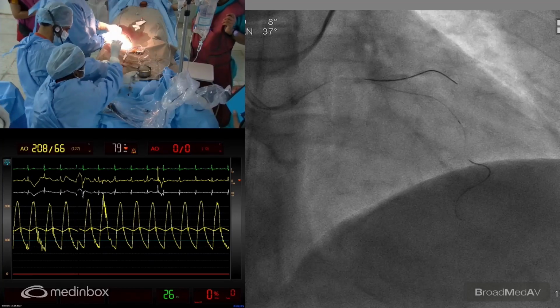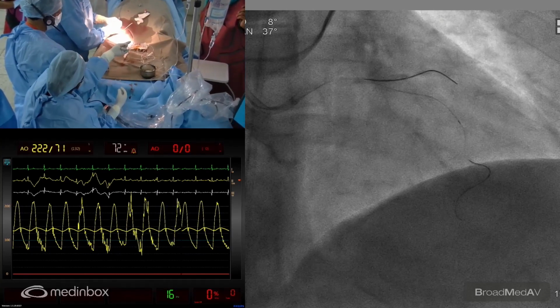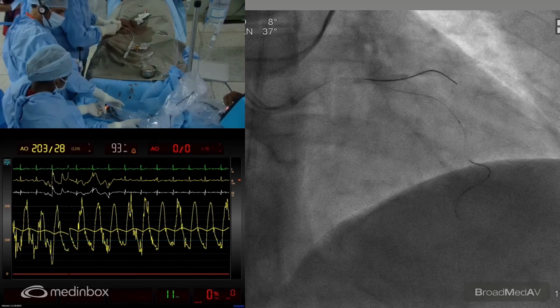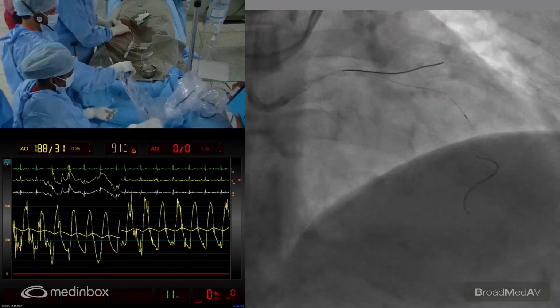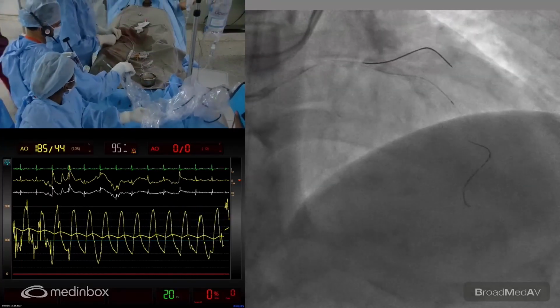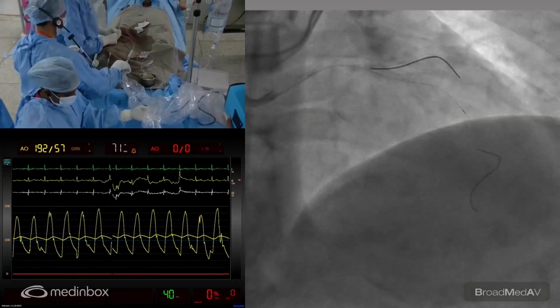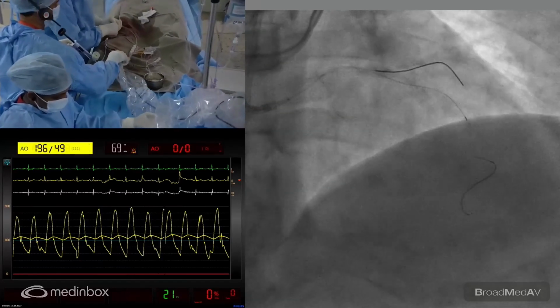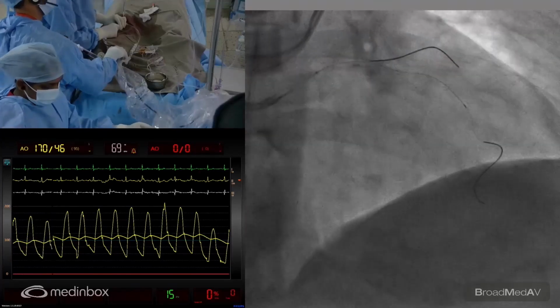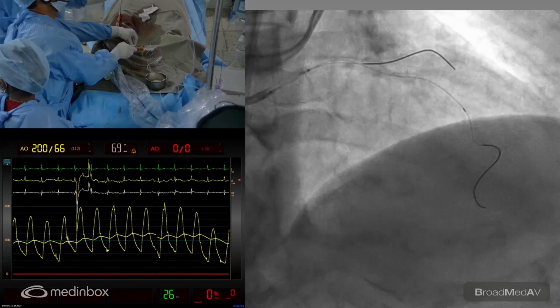And what we're going to do now is quickly get the 3.5 coronary IVL shockwave lithotripsy balloon down into the left main. And then once we are at the site, we will inflate. There is no trouble in keeping 2 wires when we're doing an IVL. That's a good part of the whole story. I hope this IVL catheter will track down the left main. We had not much difficulty in the left main, so here is the catheter coming, and I think we are through. So we are across, the pressure is okay, small check please.